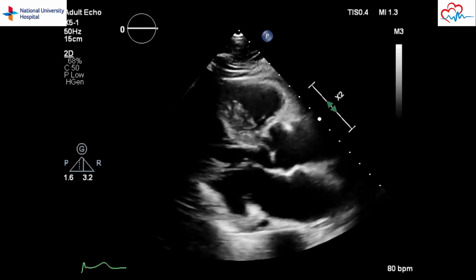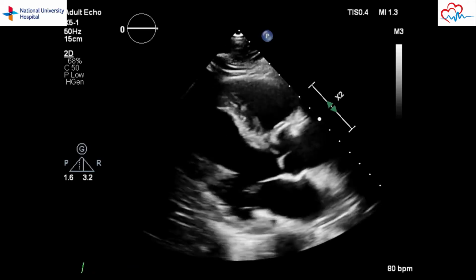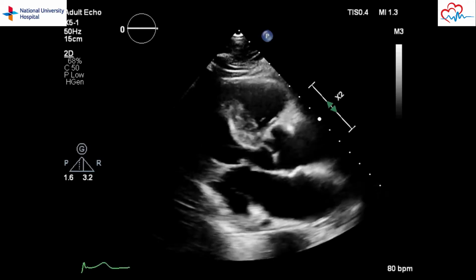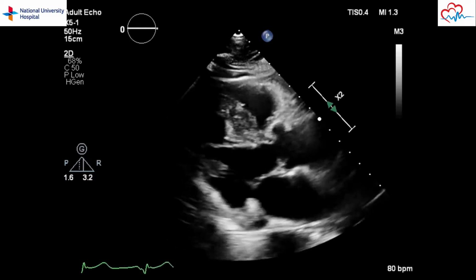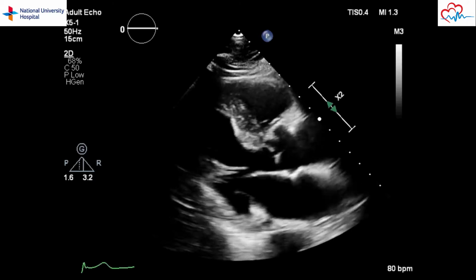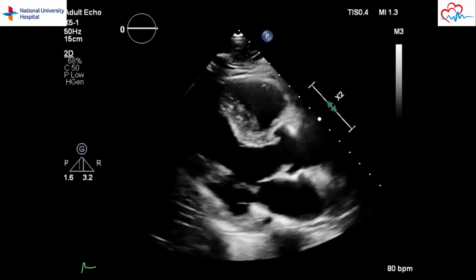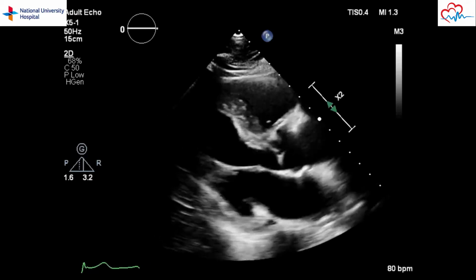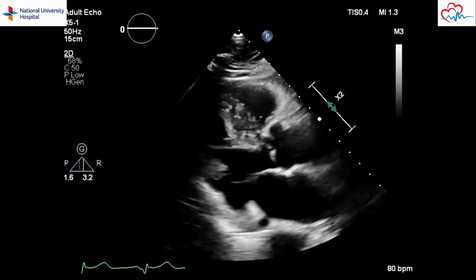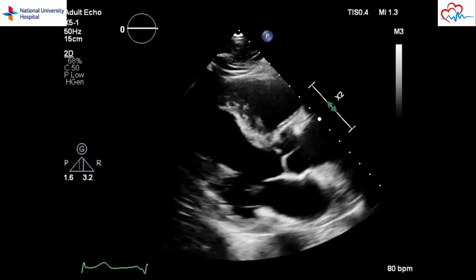The left ventricle should appear perpendicular to the ultrasound beam. The apex is usually not visualized in the PLAX view. In this view, 2 of the 3 aortic valve leaflets can be seen in the long axis. Zoom can be applied to the aortic valve and mitral valve to visualize the valve in detail. Color Doppler can be used to interrogate the mitral and aortic valves for evidence of regurgitation.